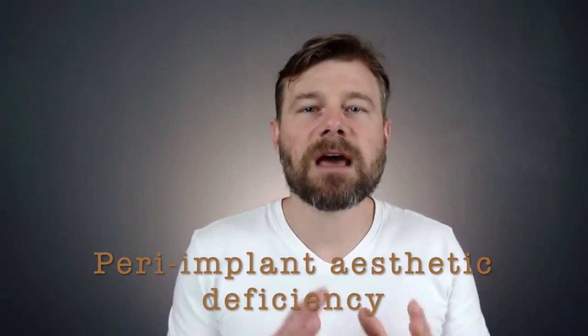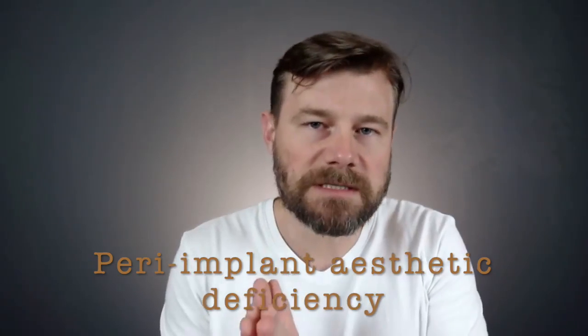I'm here to present a series of cases for you that are going to bring a very nice subject: how to treat and how to choose the right approach for aesthetic deficiency of peri-implant tissue in the aesthetic zone. So in the cases, we receive the patients with the implant already in place and you have some problems to treat.